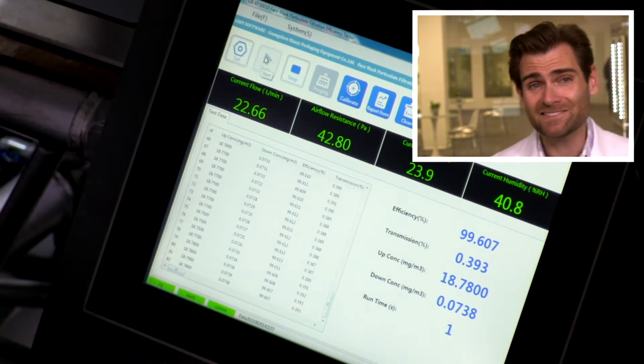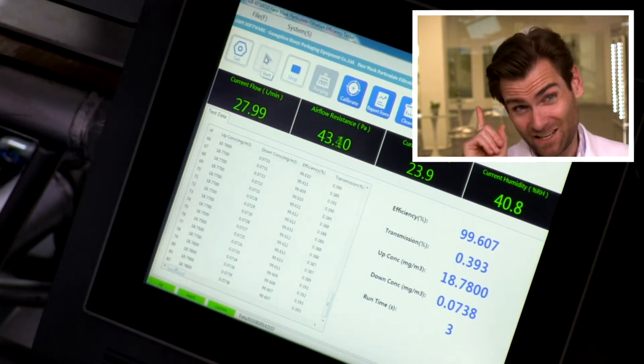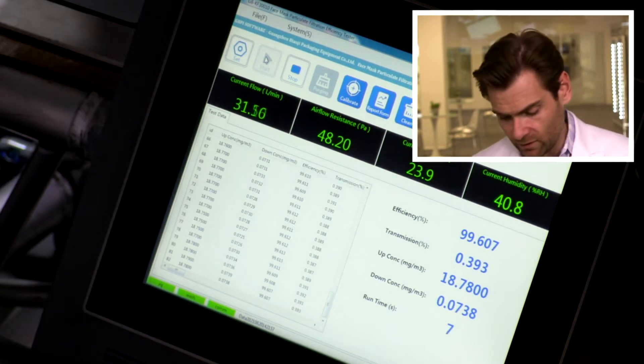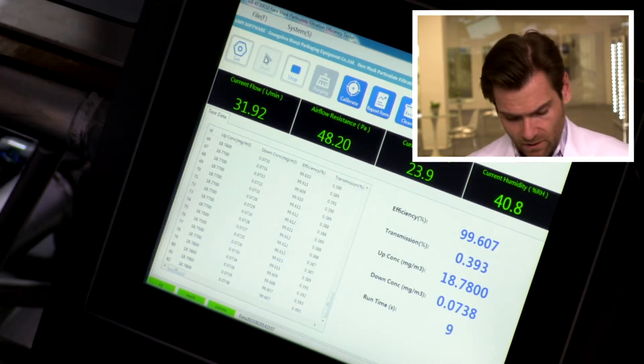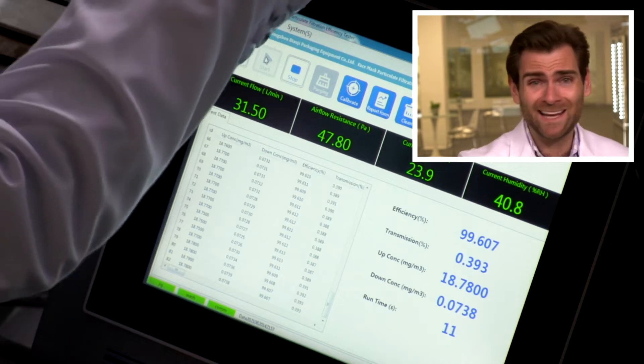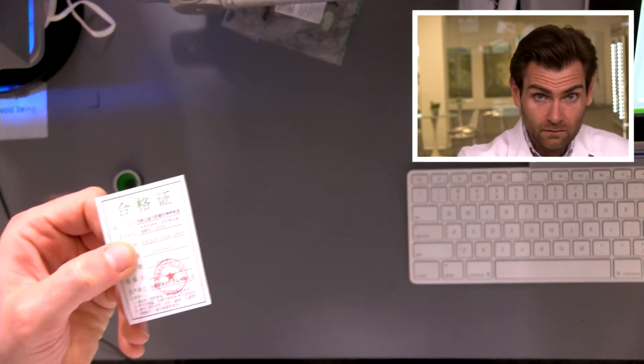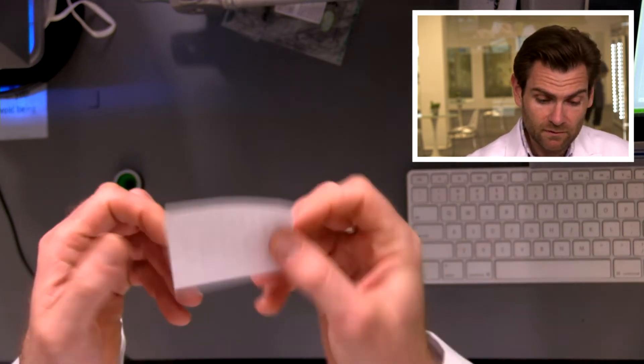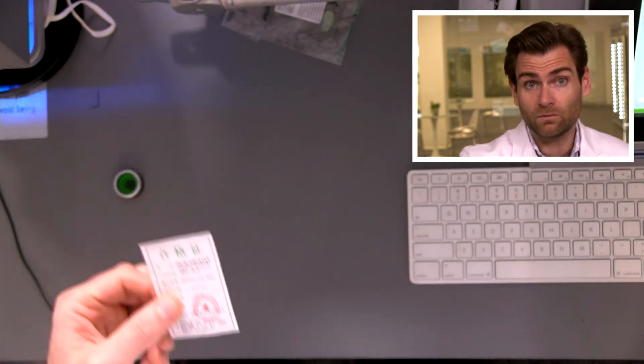Let it rip. This is a particulate filtration efficiency machine. If you want to find out how this works, check out the link. The setup is a little bit different here. This has got a quality certificate on it, and it does say the standard right on there — GB2626-2006 KN95. Maybe it's legit. We'll find out.